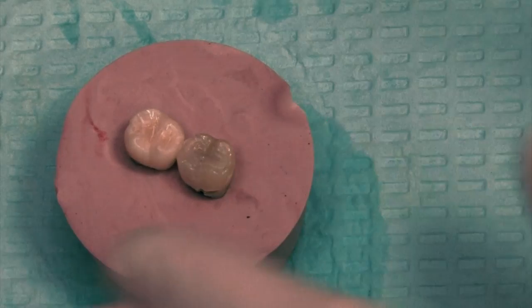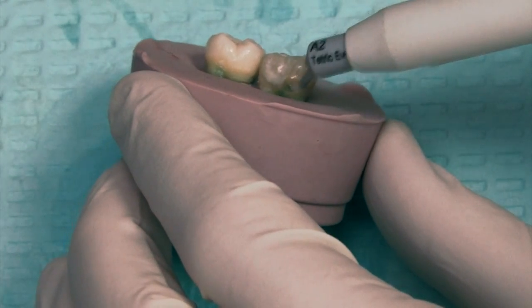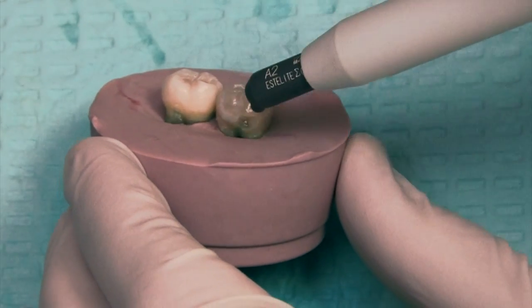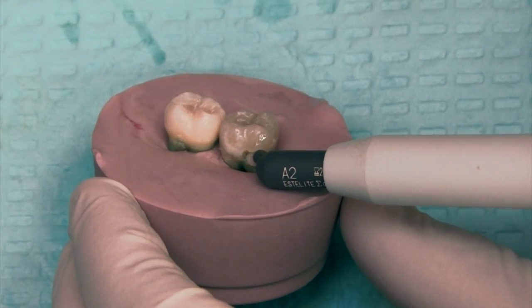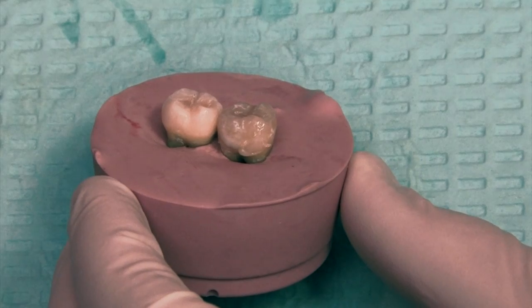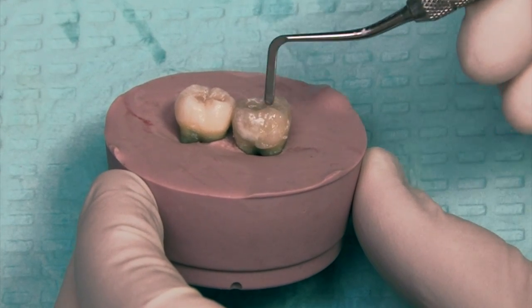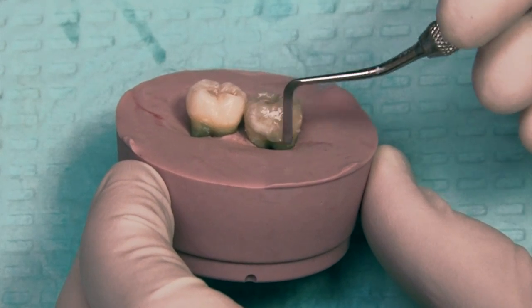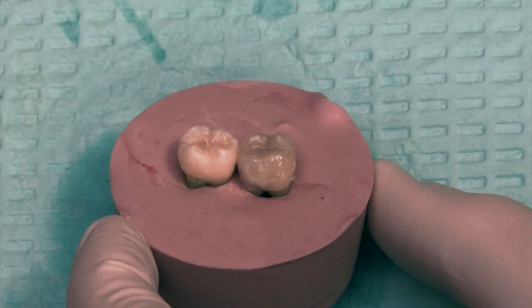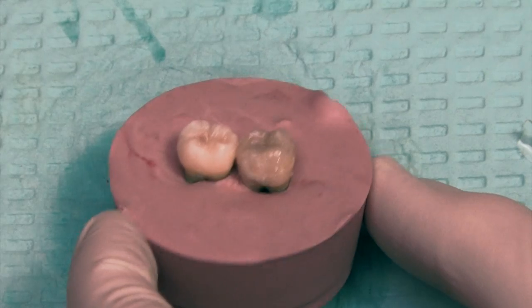Similar to what we did earlier, you could go in with the regular hybrid composite, but I'm going to start with just a dab of flowable — just a little bit. We're not going to try to fill up the entire prep with flowable since flowable shrinks too much. Then put in our stronger, more durable hybrid composite. The flowable will kind of ooze out of the way, ensuring every little nook and cranny is being filled in. I slightly overfill it. For class 5 fillings, we use these pre-curved matrices, which come in three different sizes, because the composite tends to stick to the instrument when you try to remove it.